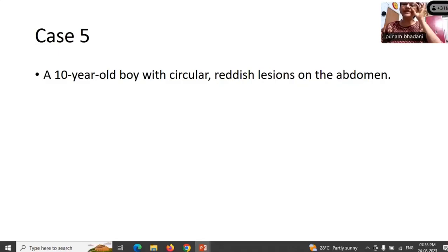Already explained all things nicely. So students should know what is cutaneous lupus erythematosus and what is generalized, whether it is systemic or cutaneous. So a detailed clinical history is very important, and the different types of cutaneous lupus erythematosus have already been explained by Dr. Raj Lakshmi and Dr. Uday. So you can go ahead. There is importance of IF in these cases also.